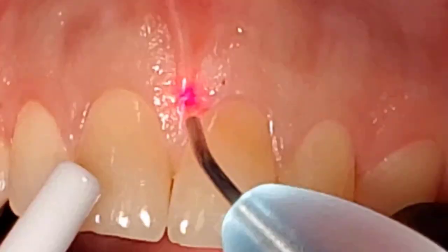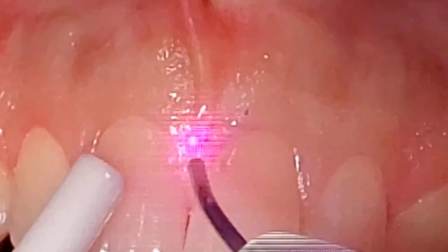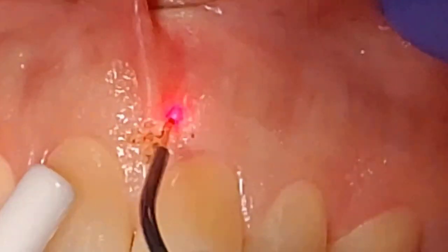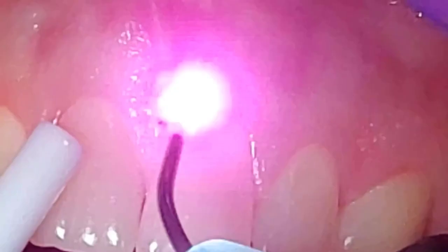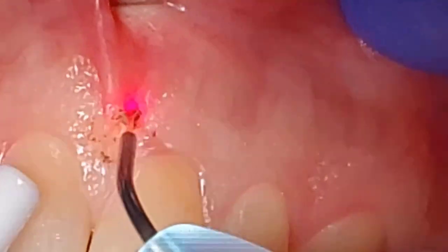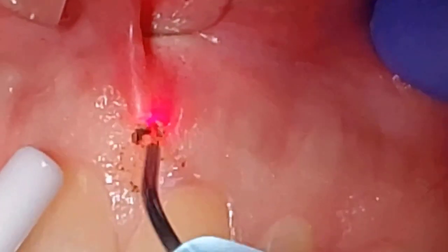And we're going to go ahead now and just little by little, in contact, begin that touch to touch of the frenum. And as we do this, in all frenectomies, the muscle is fan-shaped. So it's going to fan out like that of a diamond or a baseball diamond. Notice how cleanly the Gemini performs here.